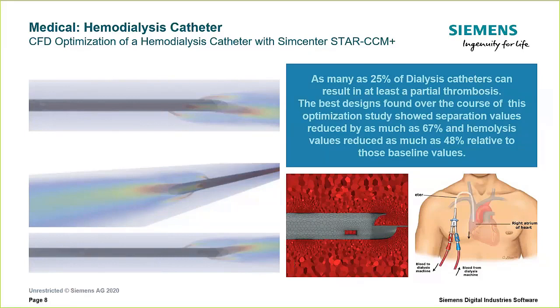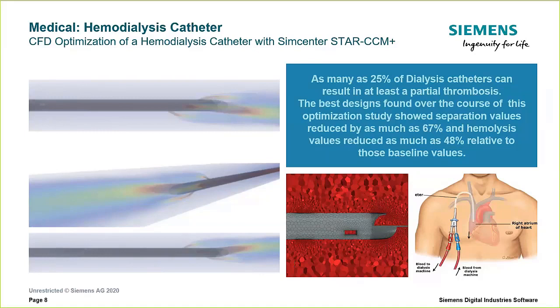Today we'll look at simulations of this optimized catheter design placed within a range of virtual patients, each with slightly different anatomies, to see how the catheter performs in its intended environment — accounting for patient variability. We'll also illustrate how simulation assesses operational variability, since catheters aren't always placed in exactly the same position. It's a good time to turn it over to Julian, who will discuss how Materialise develops virtual patients.